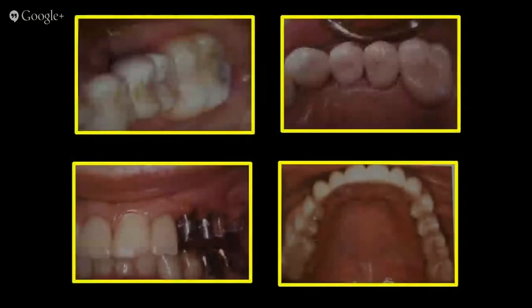The patient has not come to you asking for a class 1 relation as far as canine or a molar goes. We can still give away that as far as a cross-bite relation goes. But in the long term, success is guaranteed because we are giving axial loading.